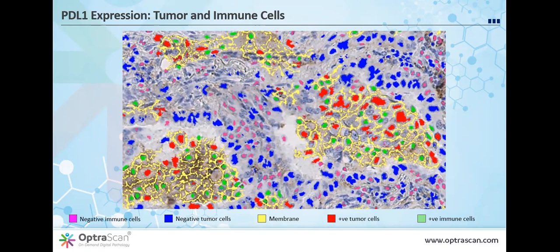It is an extremely user-friendly and intuitive platform, allowing the user to perform multiple operations on a single screen. Now I would like to emphasize a little bit on the advantages of this tool.